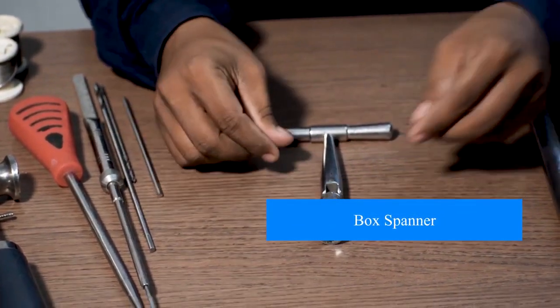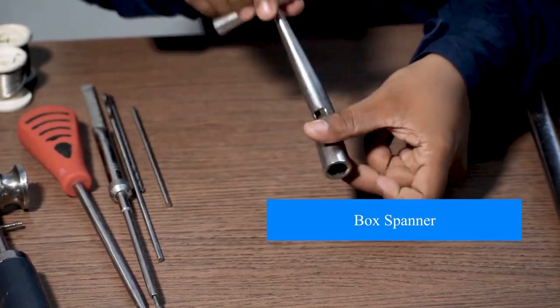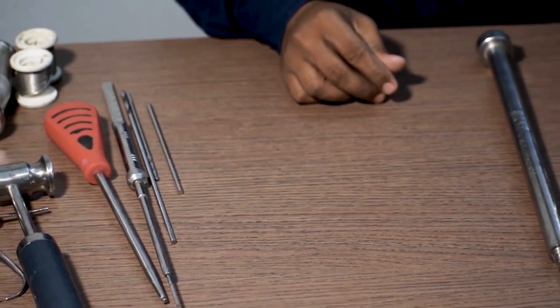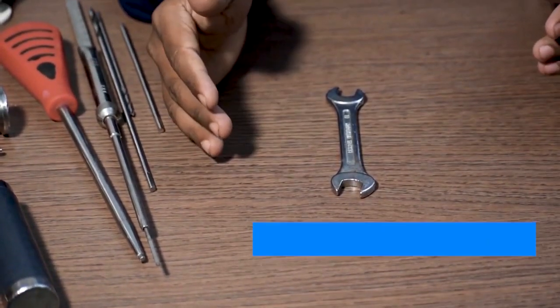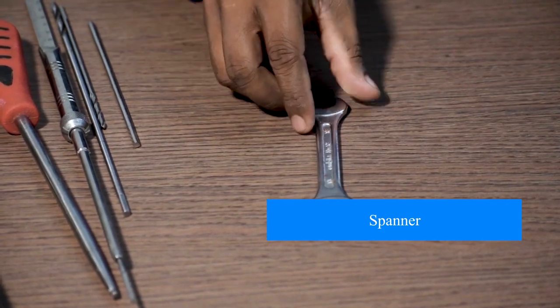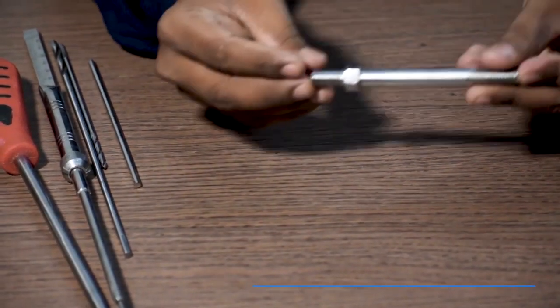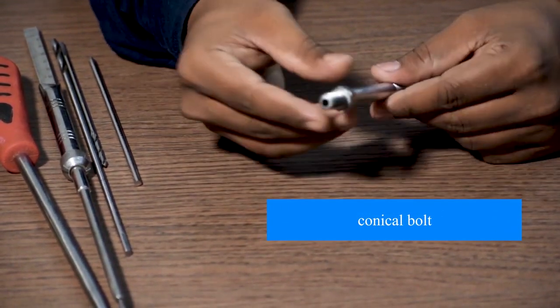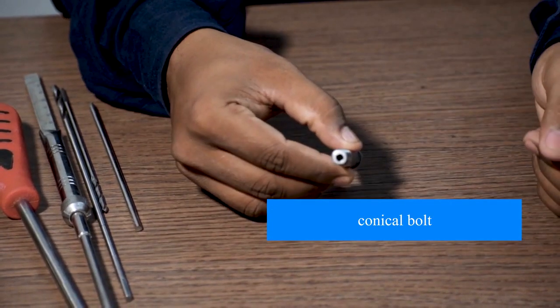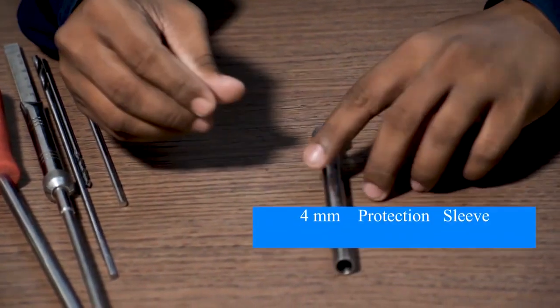Next, this is a box spanner, followed by a regular spanner. Next, a 4 mm protection sleeve.